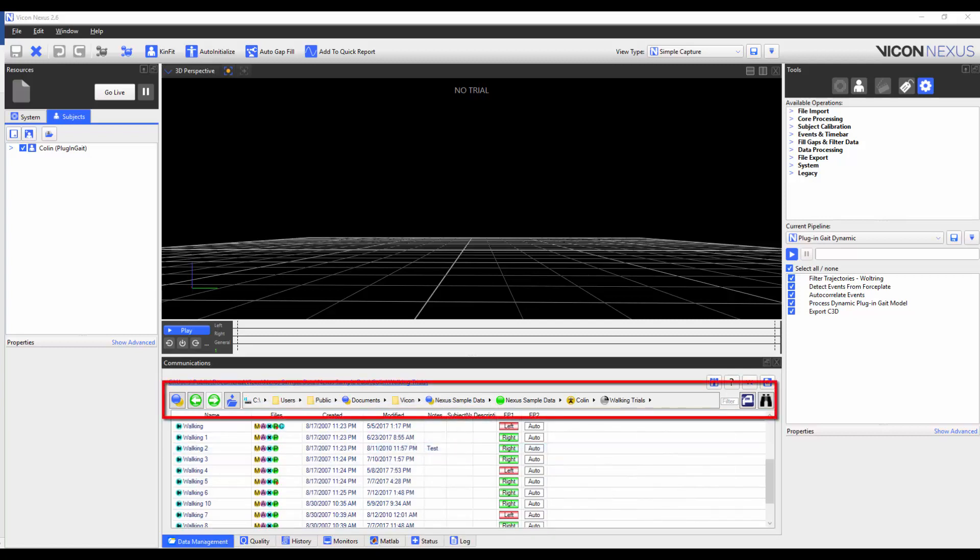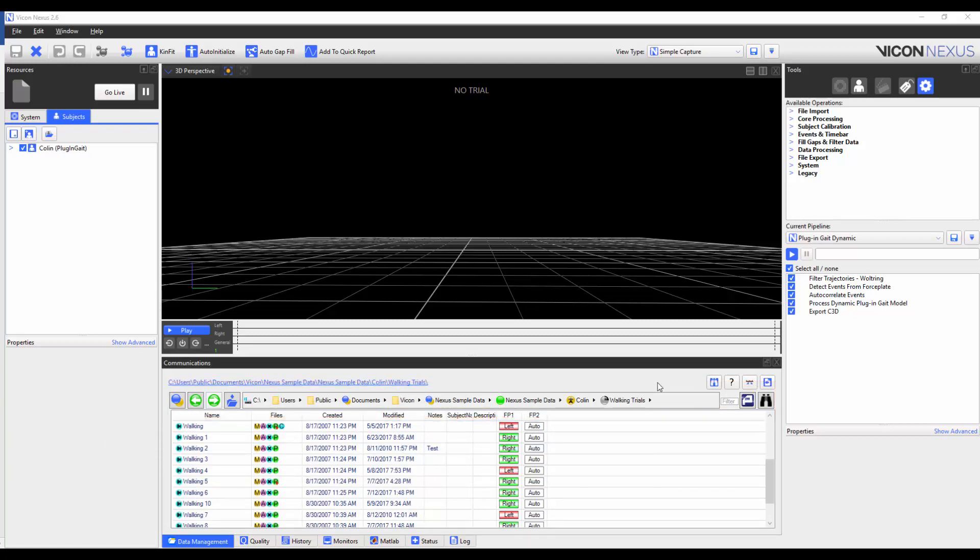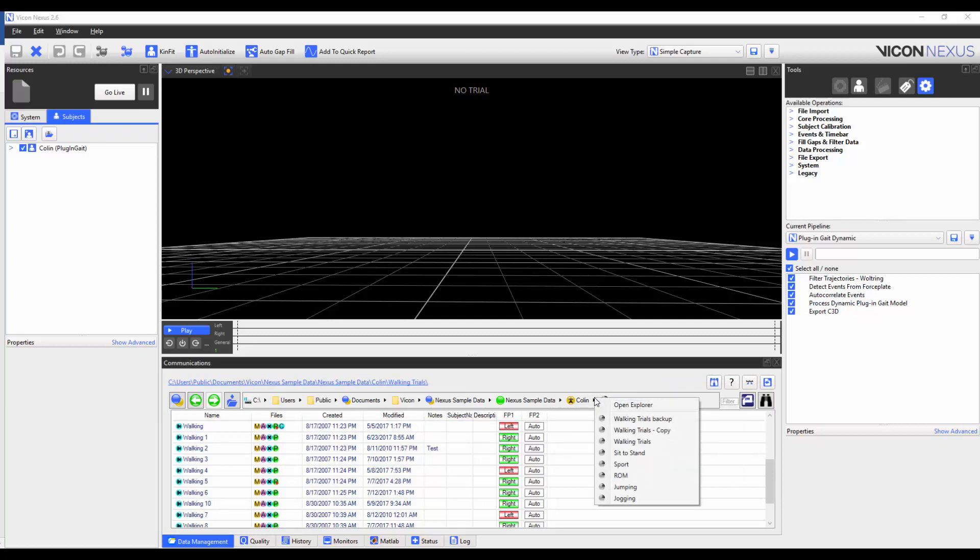The LivePath link at the top of the pane now contains icons and arrows that, when clicked, give access to other folders at the selected level. You can also use these to open the equivalent folder in Windows Explorer.